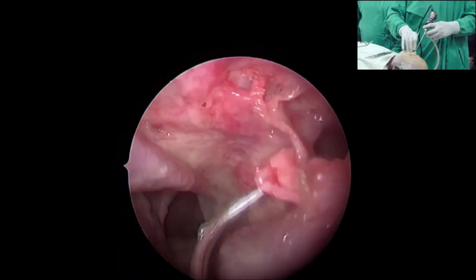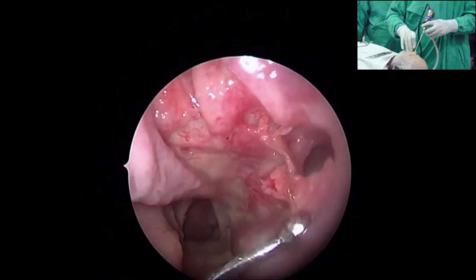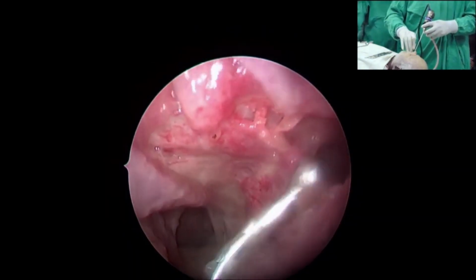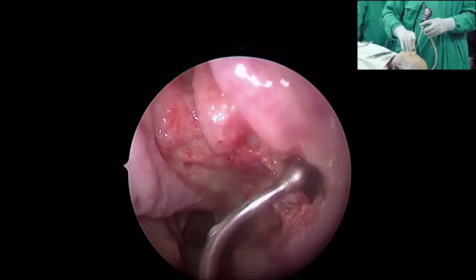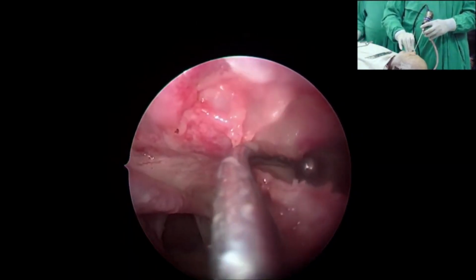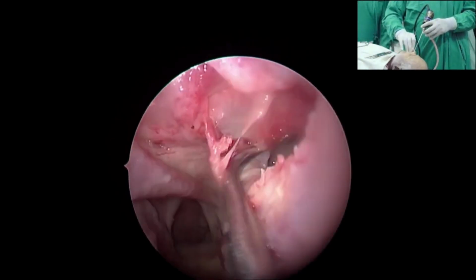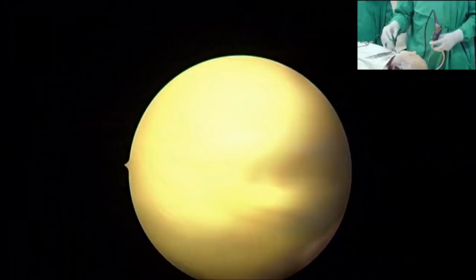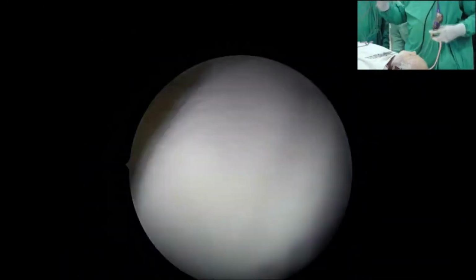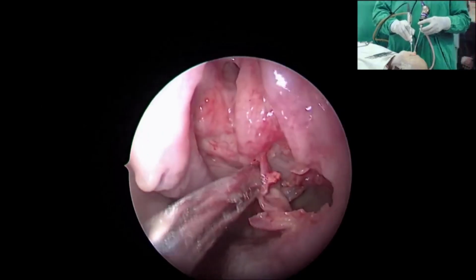If you find some opening in this region, maybe anterior or posterior to the uncinate, looking like an ostium, they are never the natural ostium. They are always accessory ostium or fontanelle, where the bone is deficient and only 2 layers of mucosa on the other side form the walls of the fontanelle. So those are punched out defects. They are never seen through 0 degree.